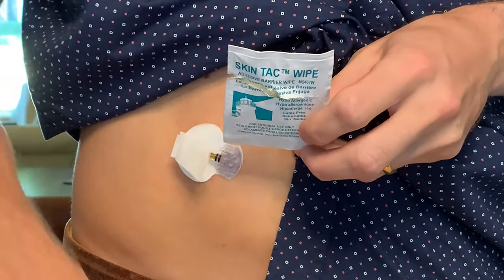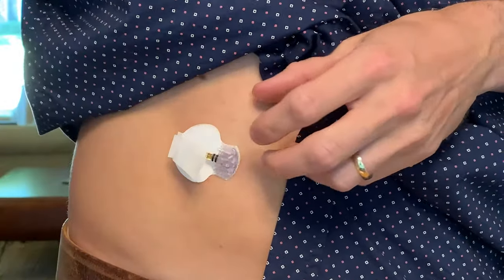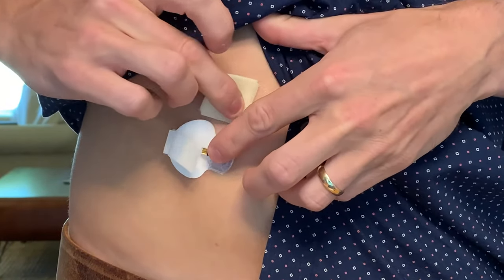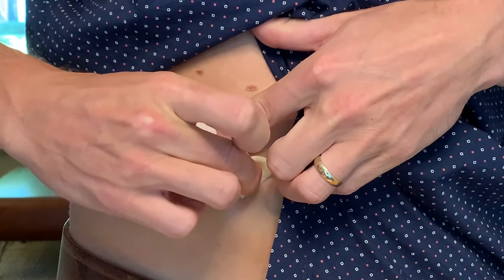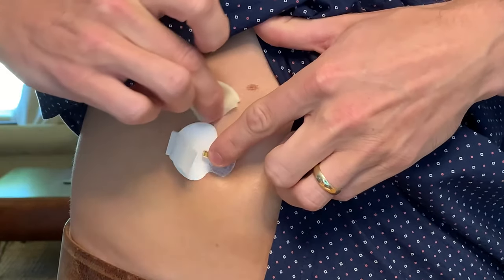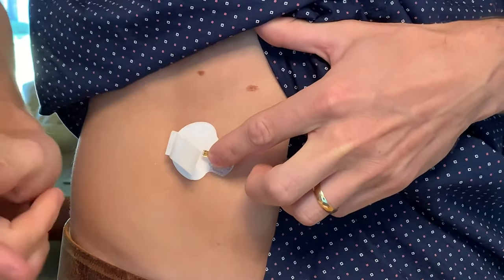I've opened the adhesive and I'm going to wipe it around the sensor and under the sensor like this. I'll make sure to hold the sensor in place so it stays secure and wait for the adhesive to dry completely before moving on to the next step, which may take up to a minute or two.